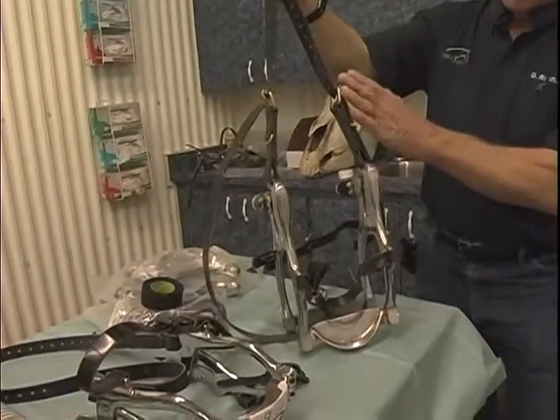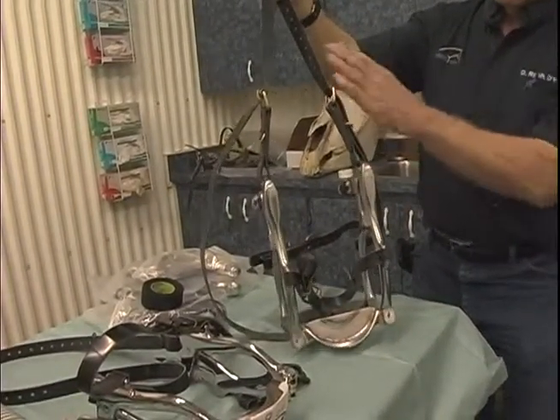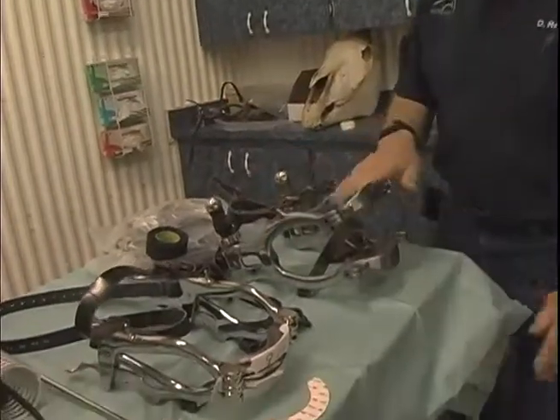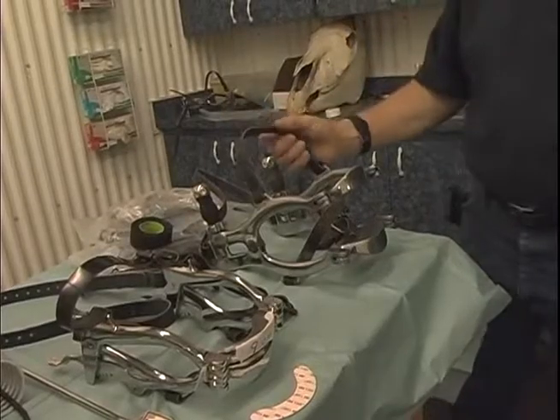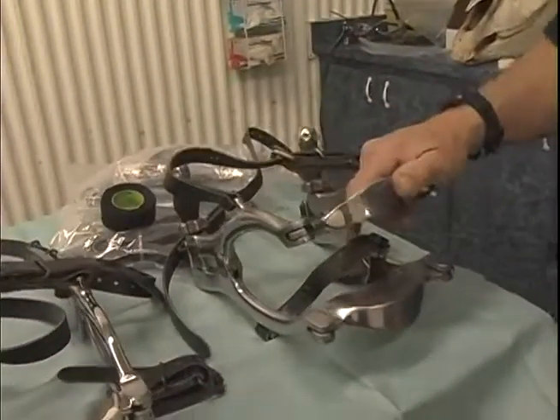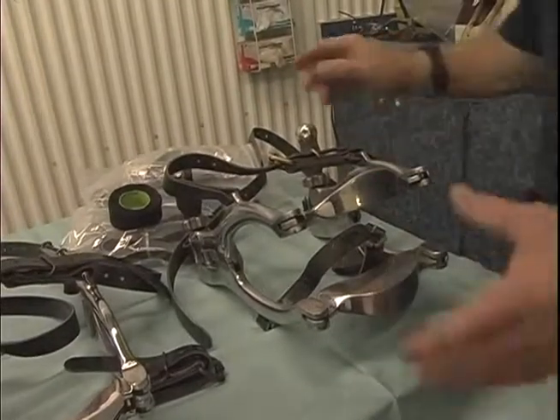You will still be able to stand on the left side of the horse and do up the pole strap to tighten the speculum. This is my personal speculum. It is approximately 6 years old now, and I expect a speculum like this to last a lifetime.